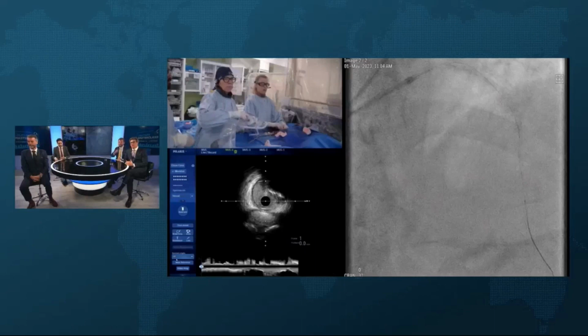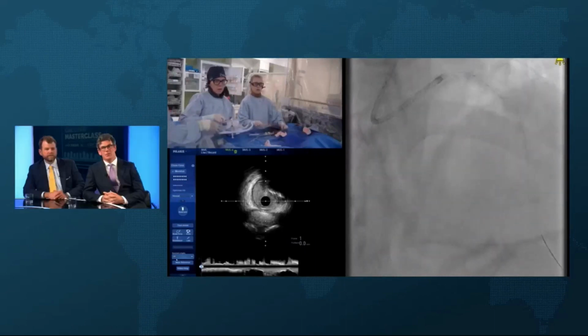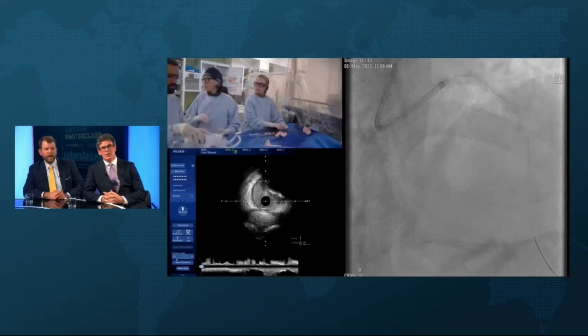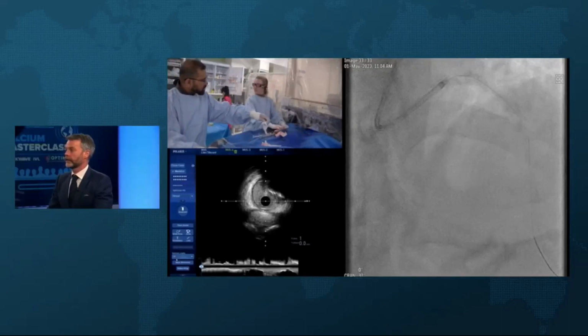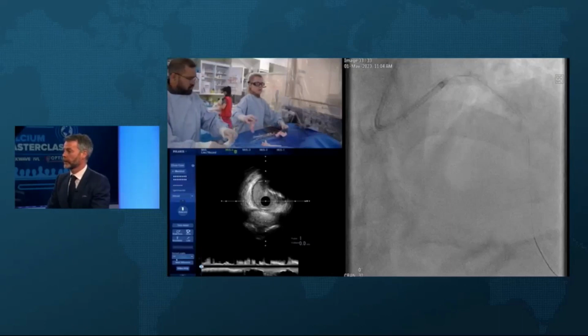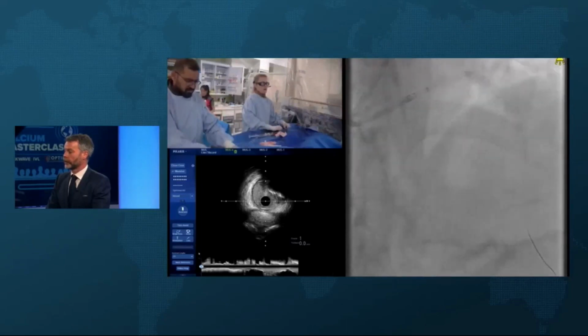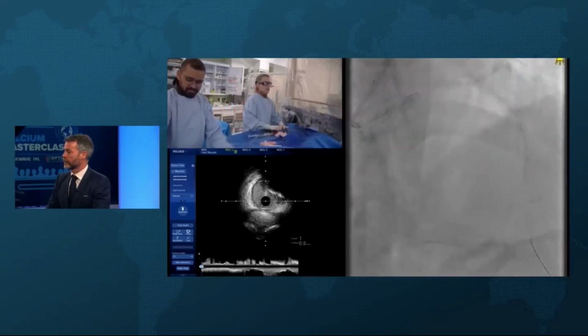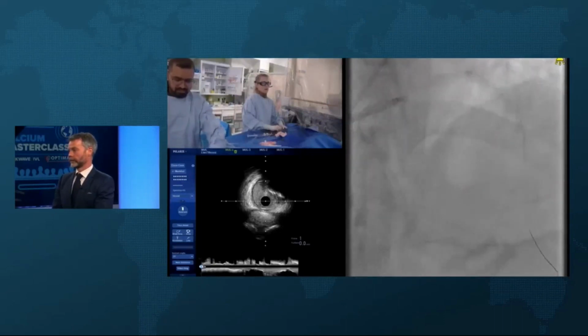So what's the EEL in the proximal LAD? You're going left main, I presume, here, are you? It looked like it's, I think it's 4.5, isn't it? Proximal LAD. I mean, just talk us through that IVUS, Margaret, maybe while Claudia is working, just to show us the learning points for the audience and where you're going to go in terms of stent sizing, etc.